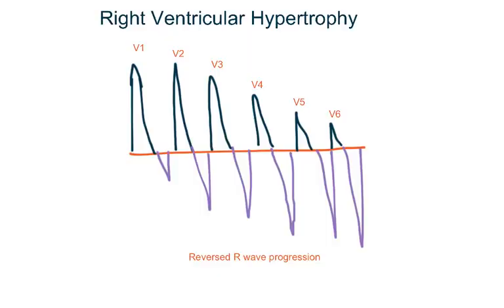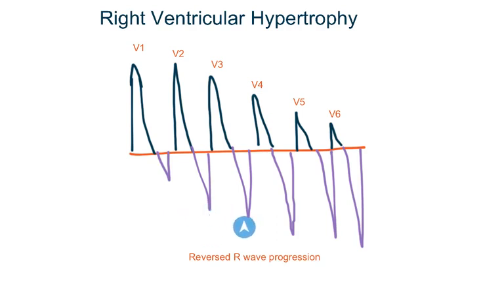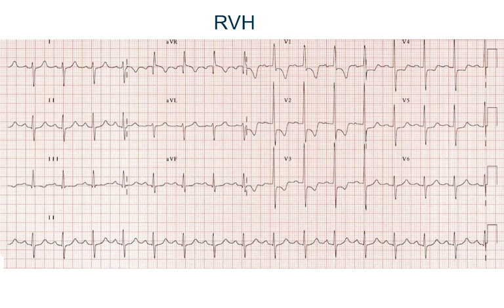In right ventricular hypertrophy, the R wave progression is reversed. That is, the R wave is tall in V1 and V2 and then starts decreasing in length up to V6. If you look at the ECG, the R wave is tall in V1, V2, V3 and then it starts decreasing — V4, V5 — and it's very tiny in V6.